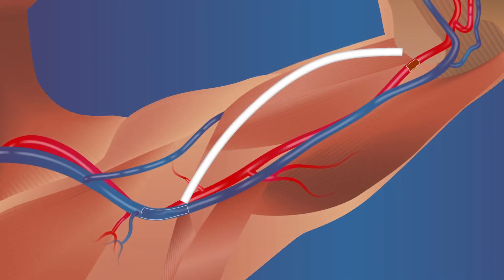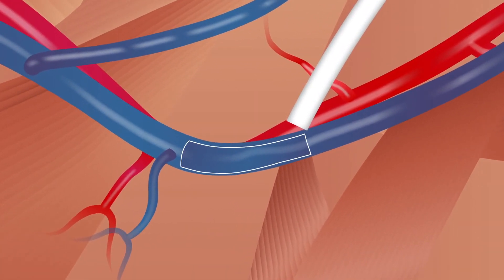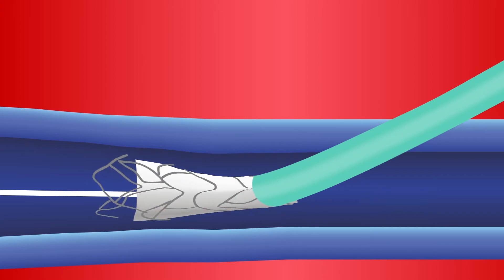The venous intergraft connector is placed first. The venotomy site is selected and vascular access is obtained. A vascular sheath, shown in brown, is introduced and a guide wire is placed across the site where the connector will be deployed. The venous intergraft delivery system, shown in blue, is inserted over the guide wire and positioned at the deployment site. The sheath is removed, then the delivery system is retracted to deploy the venous connector.